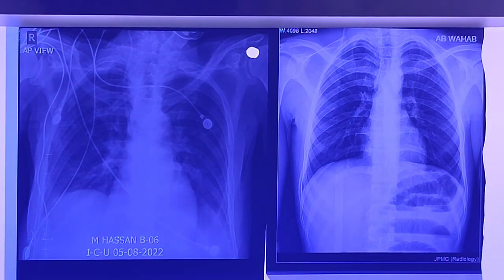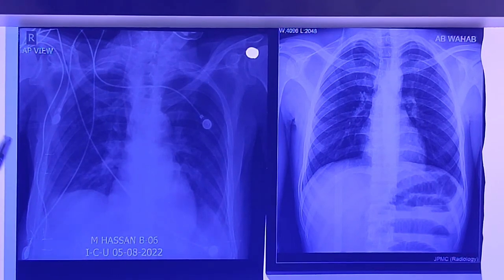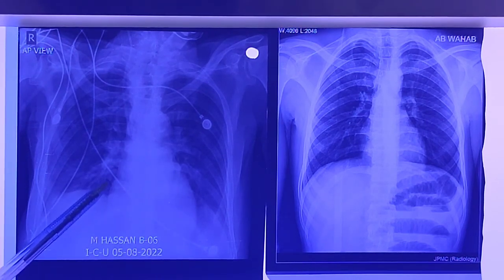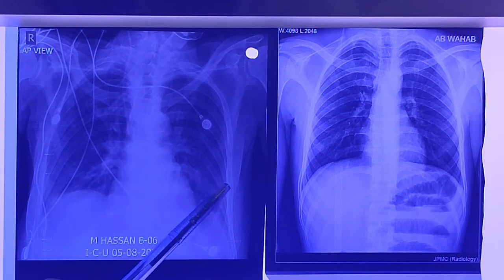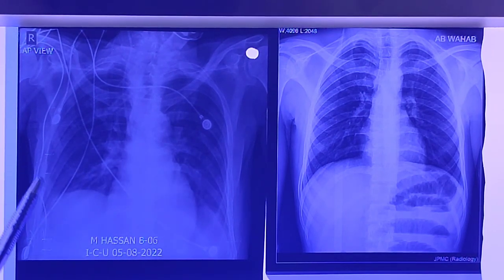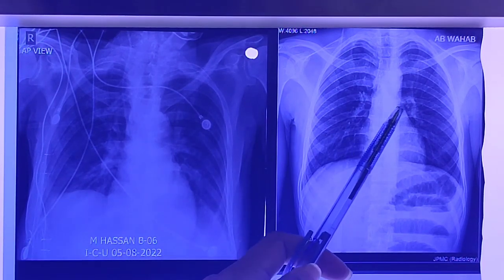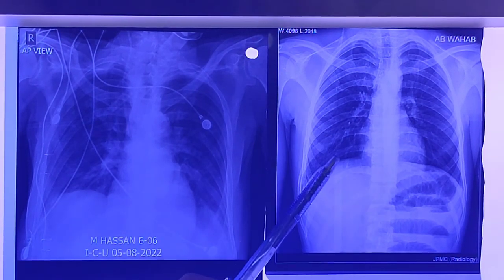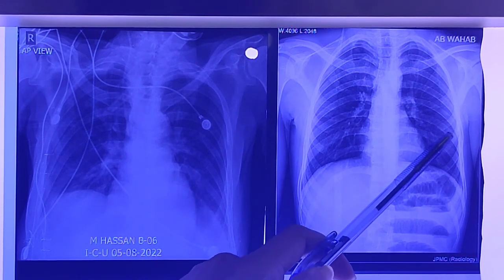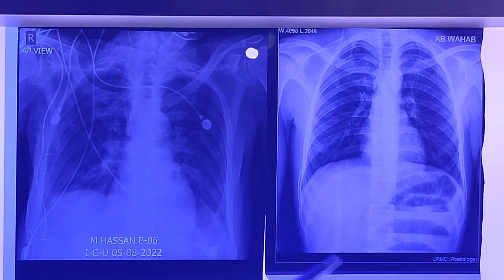Our fourth differentiating point is the heart shadow. In the AP view the heart shadow is clearly magnified, but you cannot properly measure the cardiothoracic ratio in the AP view. While in the PA view the heart shadow is not magnified.